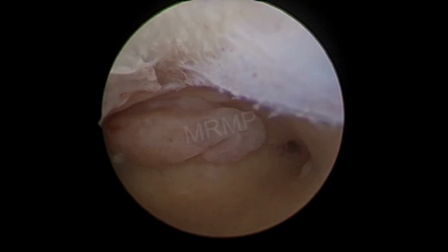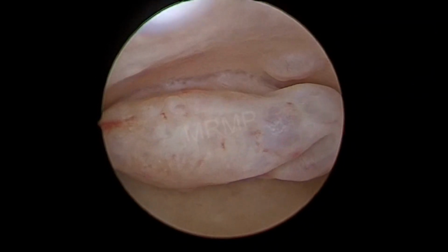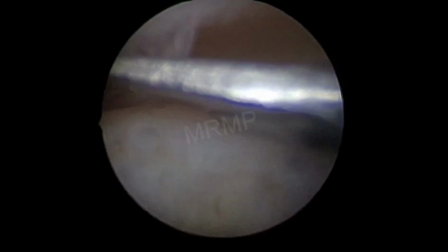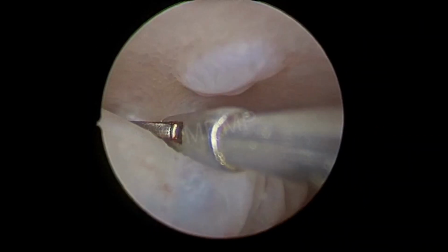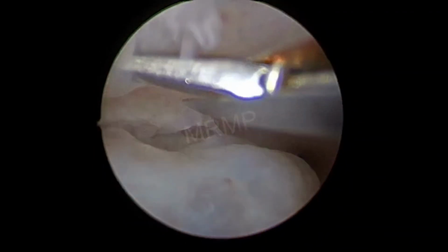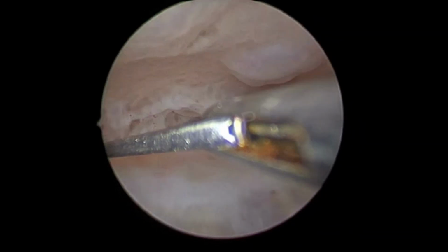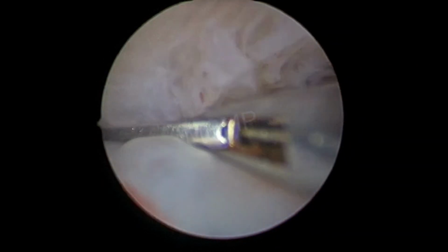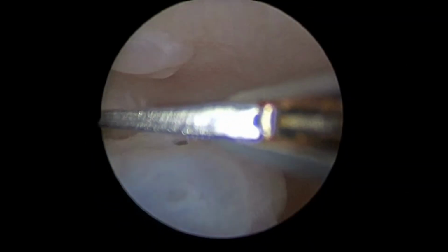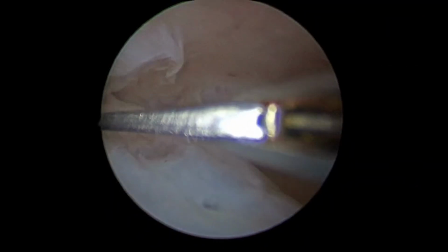Then hysteroscopic scissors are introduced through the working channel, and always look and plan where to cut the polyp. Under steady visualization, the scissors are positioned at the base of the polyp stalk. Always go step by step and always look for the path. You can press the polyp, look for the stalk, reassess the stalk, and again cut it.